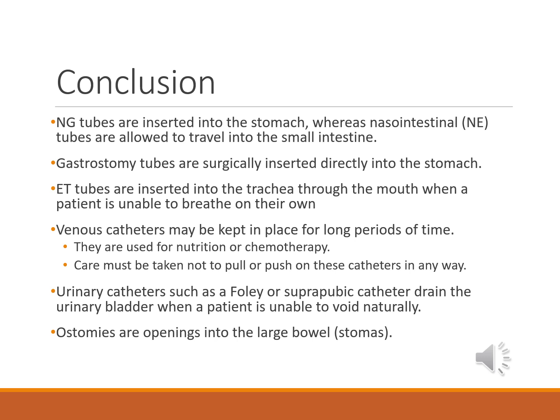Tracheostomies are openings in the trachea to relieve respiratory distress. Patients with tracheostomies may require suction. It is important that radiographers know that they do not perform the suction, however, they can assist and should be able to identify where all the equipment is within the exam room or imaging department.